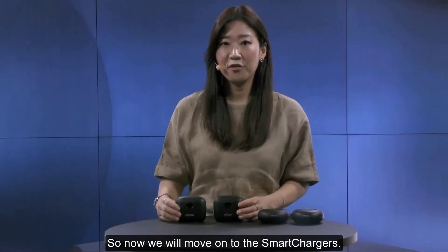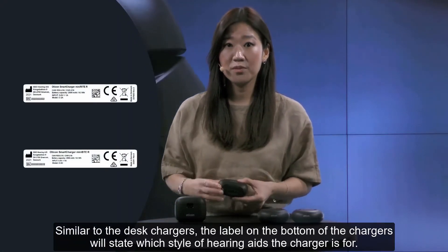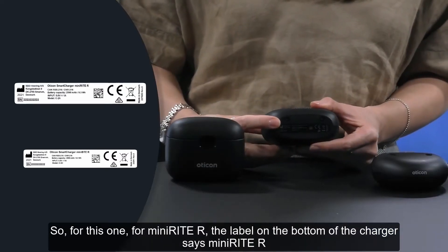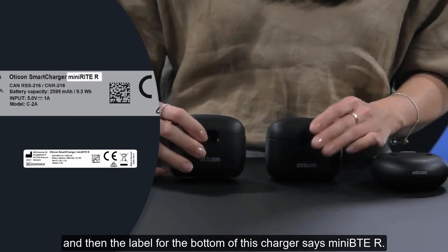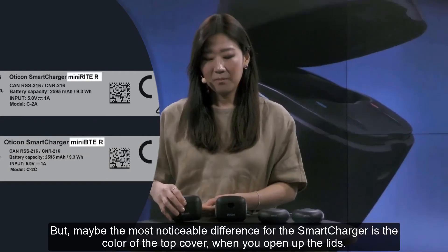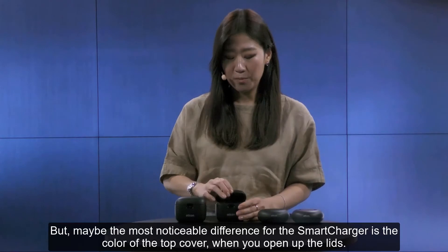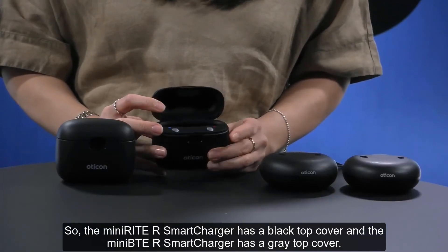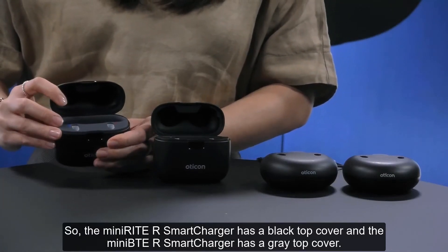Moving on to the smart chargers: similar to the desk chargers, the label on the bottom will state which style of hearing aids the charger is for. This one says Minirite R and this one says Mini-BTE R. But perhaps the most noticeable difference for the smart chargers is the color of the top cover when you open up the lids. The Minirite R smart charger has a black top cover and the Mini-BTE R smart charger has a gray top cover.